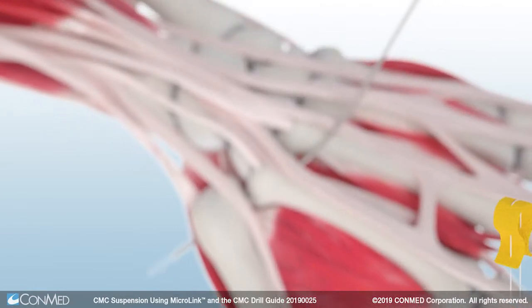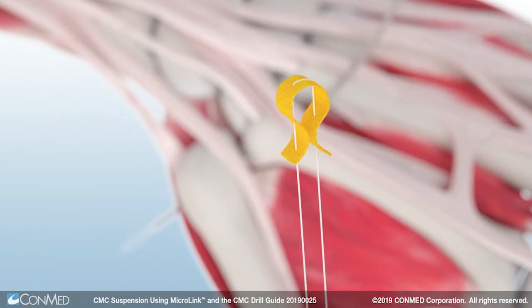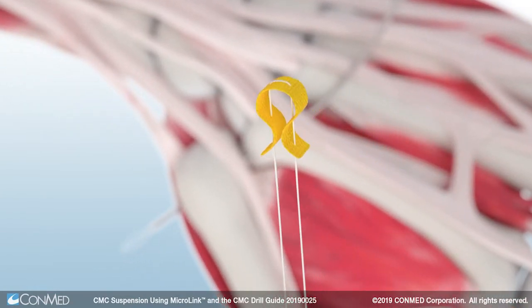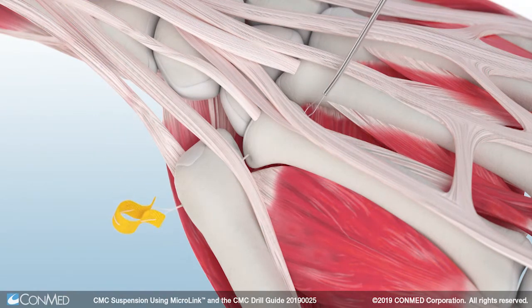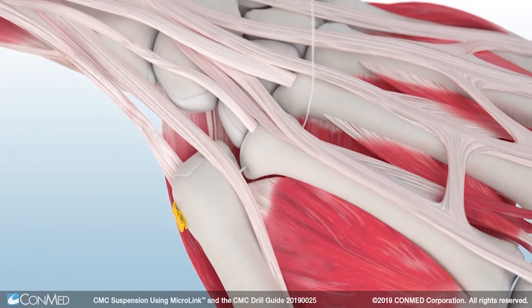Then, pass two centimeters of the number two hi-fi suture tail found on the Microlink all-suture button through the nitinol loop found on the end of the suture passing drill. Manually pass the suture passing drill through the second metacarpal tunnel until the suture tail has been passed through both the thumb and index metacarpal on the dorsum of the hand.